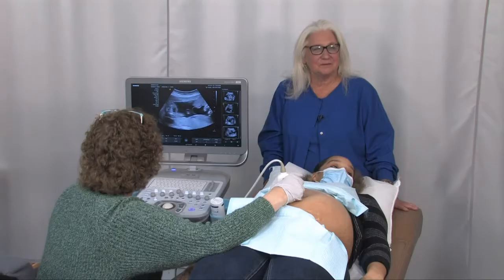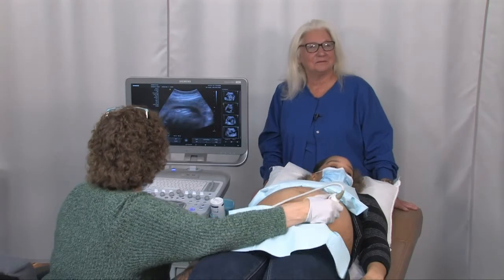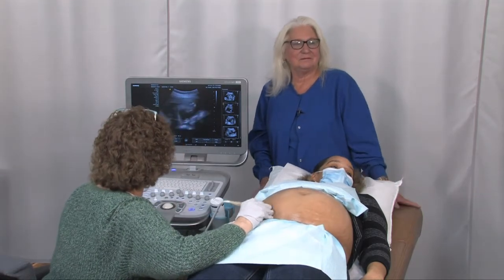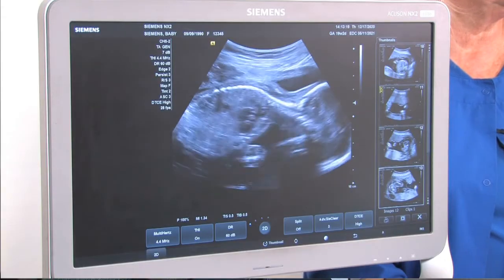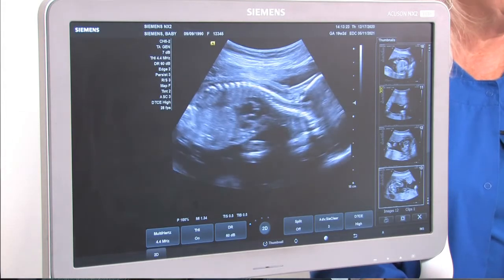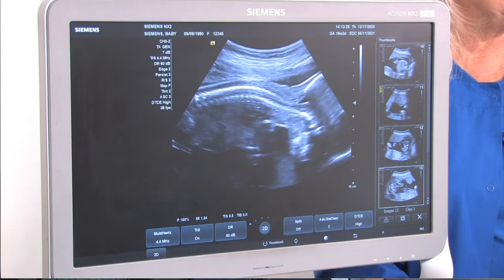Oh. Okay, so you want some cute baby pictures. Alrighty, so let's see. Let's go back to baby A. We'll stick with A first. And this one's going to have its face looking straight down. So I'm not going to get a nice profile, but I do have a nice spine in the back of the neck.